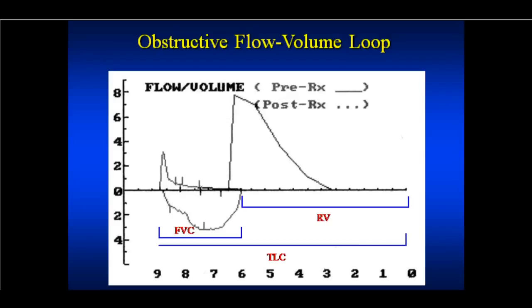Well. Okay. I'm just going to flash through these because I think I've already made some points about the flow characteristics, which is really what we're looking for, the flow volume loops. Just to reiterate that in an obstruction with destruction of the lung and a loss of elastic recoil, you get over-distended. Remember that term? Airflow limited, over-distended, huge residual volumes. Total lung capacity is huge.